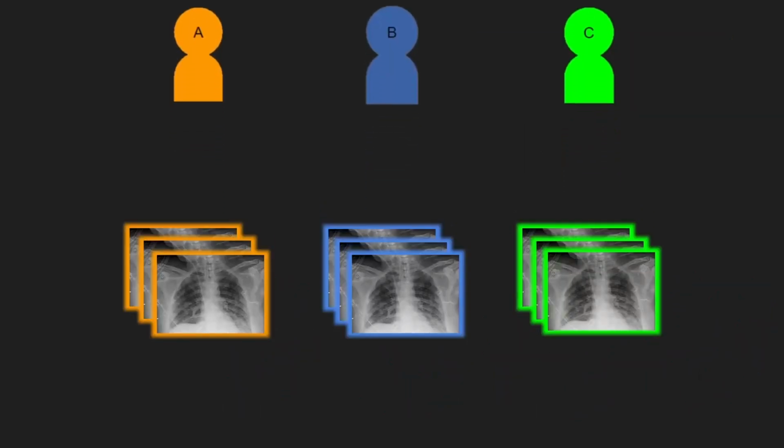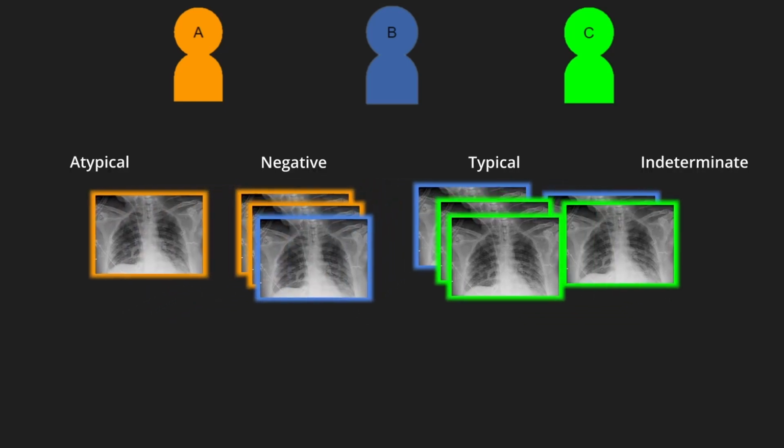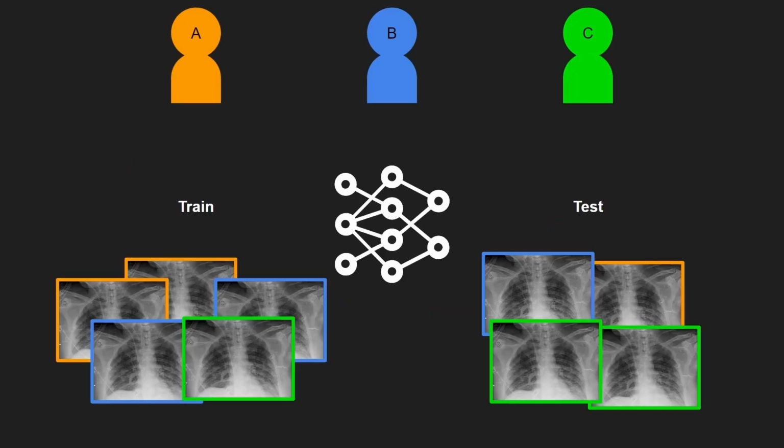Our first approach was a fairly simple one. Take the scans, pool them all, and then sort them according to which label they belong to. These labeled scans are then divided up into a training set and a testing set. We put 75% of our scans in training, 25% in testing.